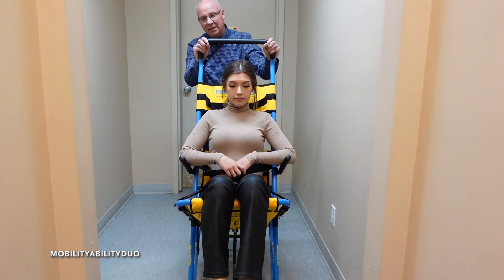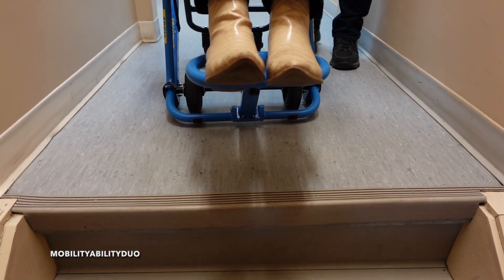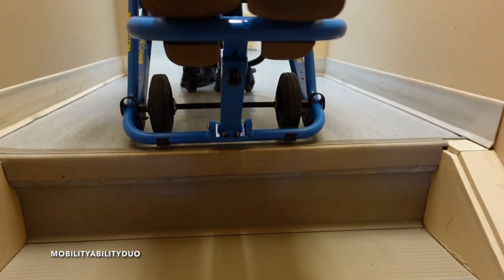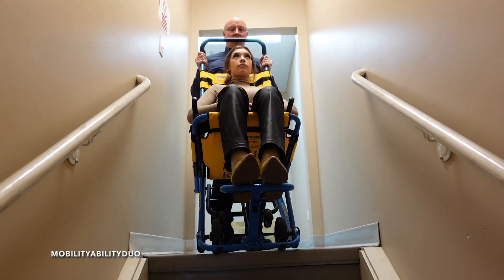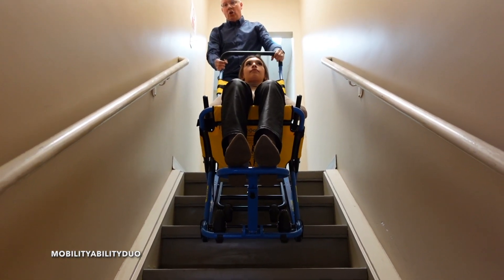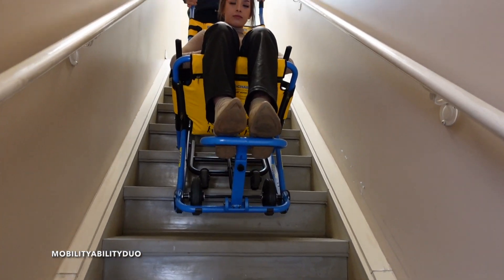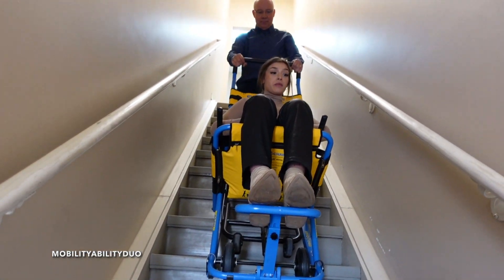So we're going to come up to the step. The design of this is the handle is really high. You can see where the footrest is, and you come to the nose of the step - that's the nosing right here. Then you tilt the client forward, kick the footrest up, and you are going down. There's a little bit of weight you're holding but it's not a lot. The track has an adjustment - if you have somebody heavier you can set the track for more resistance so it doesn't go so fast. Kim says it's really smooth going down.